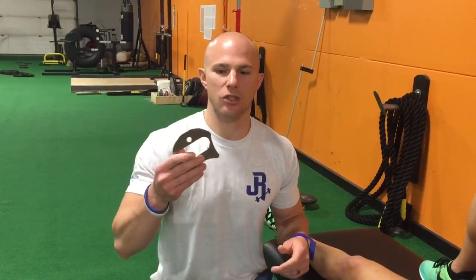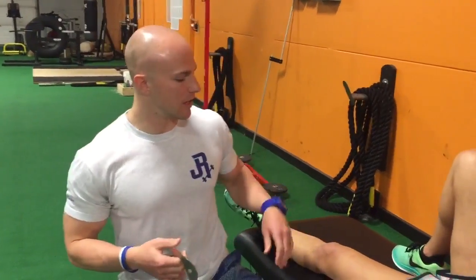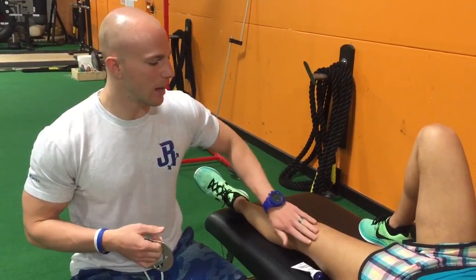The next technique we're going to be going over is IASTM — Instrument Assisted Soft Tissue Mobilization. This is the edge tool; it's my preferred tool. We're going to use it on Lindsay's vastus lateralis here.